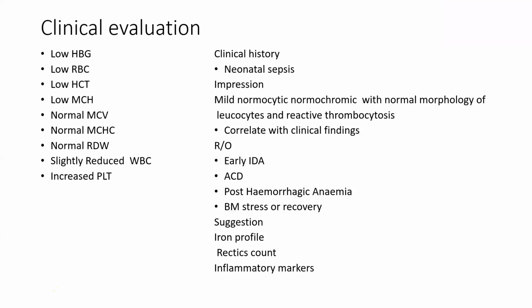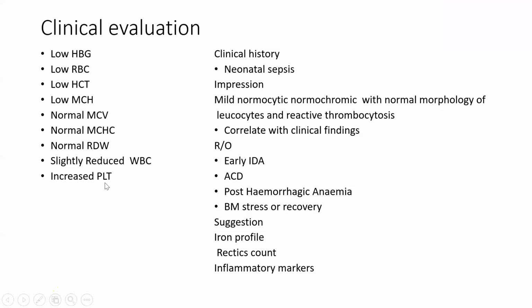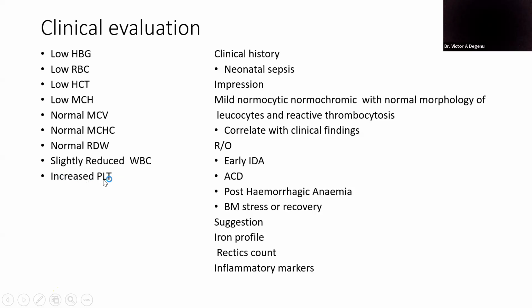Okay. So third question. You also said, what did I say? Reactive thrombocytosis. Yes. So on what basis did you say that one too? It's also based on assumption, because platelets is increased here. What will cause the increase in iron deficiency?